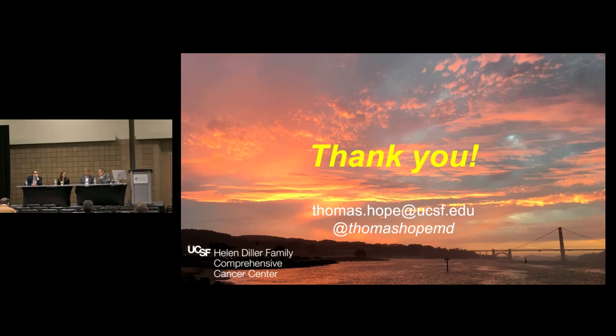Tom, are you doing PSMA CT, or are you doing PSMA MRI? Probably not relevant to most people in this audience, but at UCSF we have a PET MRI, a very cool modality with an MR and PET scanner integrated into itself, so you get both PET and MRI images simultaneously. Half of all of our PSMA PETs are done on our PET MRI, mainly because of scanner availability. PSMA 11 is a gallium-labeled compound made with a generator, so you can only make 2 doses at a time, and they have to be given, in essence, at the same time. So we put one patient on one scanner and one on the other and image them.